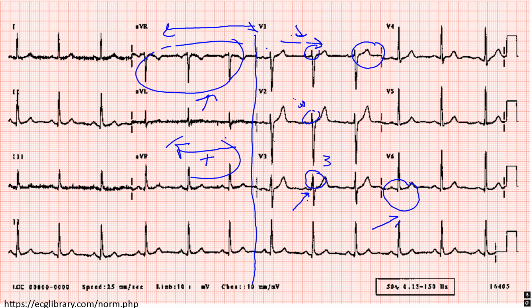Number one, come up with a system. Number two, what's a normal EKG? How does the EKG differ from what I'm seeing? How does it differ from the previous? And what does that mean?